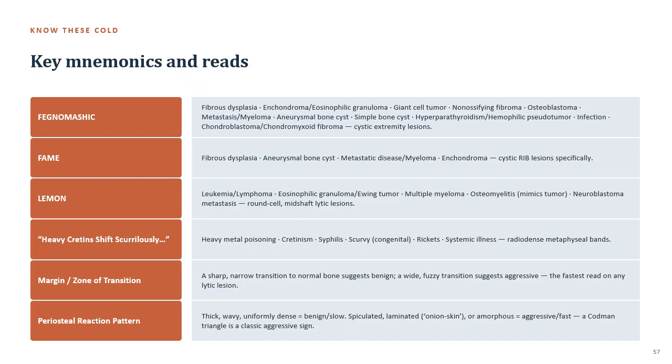If that border is sharp and narrow, that lesion is usually growing slower and contained, and more likely the lesion might be benign. Of course, there's more testing that has to be done before just saying it's benign. But if that border appears wide and fuzzy, and the borders aren't well defined, they typically classify those lesions as more aggressive, and possibly more malignant as well.